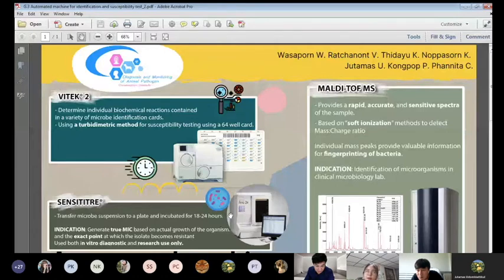So this infographic maybe talks about if the veterinarian wants to get the machine for their clinic, something like that. The target is the cost of the machine, not the cost of the sample. Question again, please. That cost in the poster, does that mean the cost of equipment or the cost per sample submission? It is the cost of the equipment. If cost per sample, MALDI-TOF is the cheapest among all these 4 types. Yes.